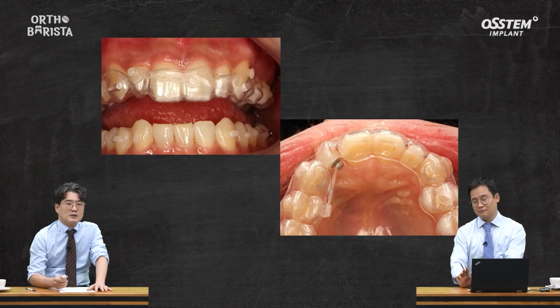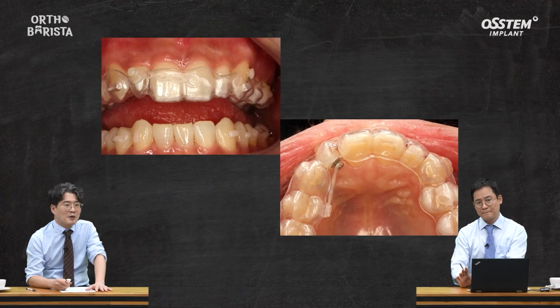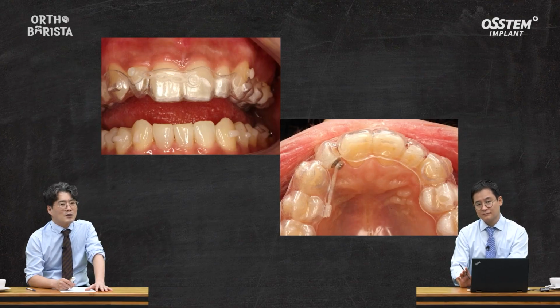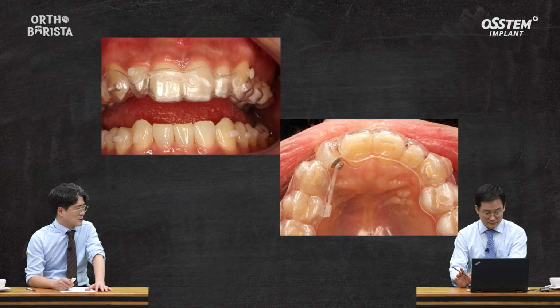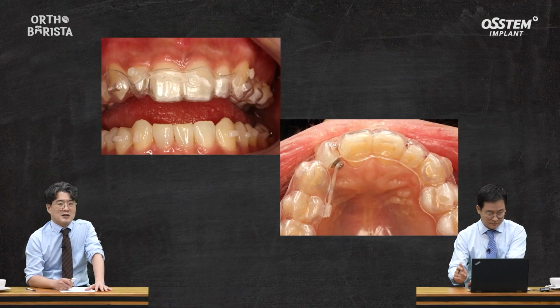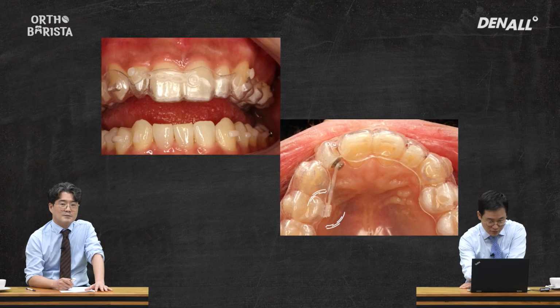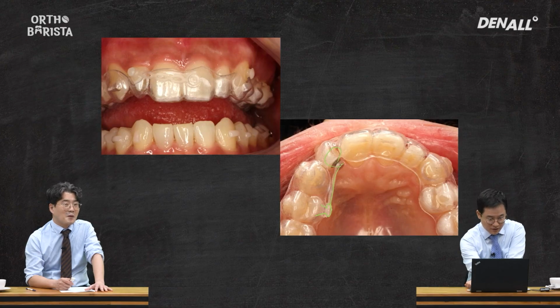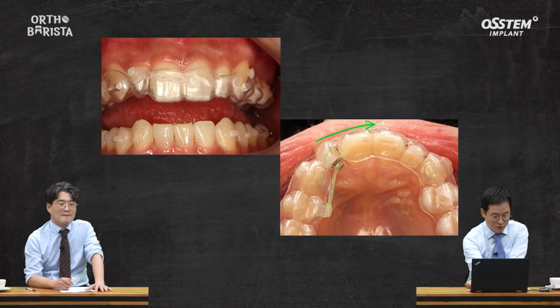Moving on to the pictures of number 12 teeth on the maxilla, this is a microdontia. Rotation is severe there. It was difficult to address this only with aligners, so I attached additional appliances. I can mark it here. Here is a button, right? Yes, that's right. A lingual button has been attached to the tooth, and is this a power chain? Yes, it is a power chain. And also on the labial side. Yes, so it is like applying a force couple here and here.